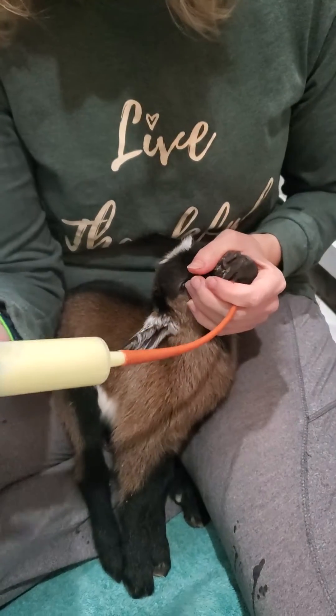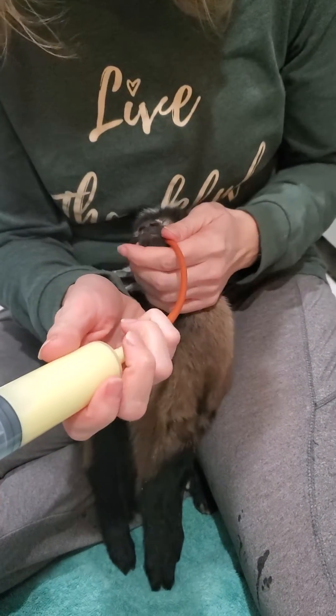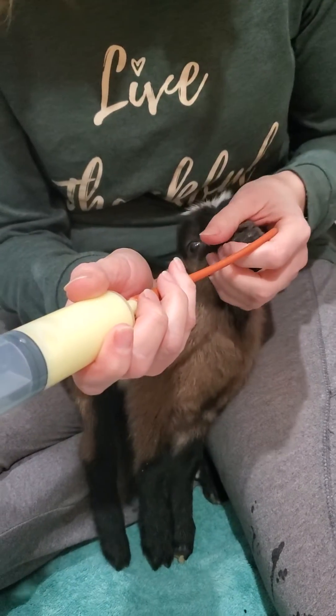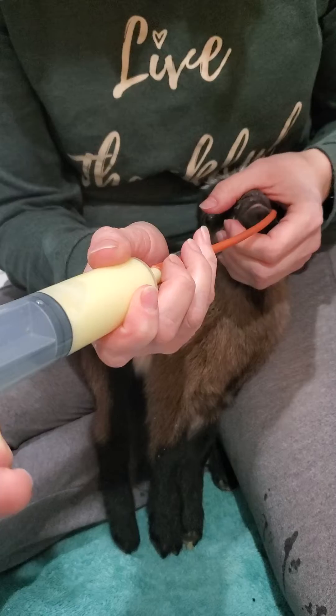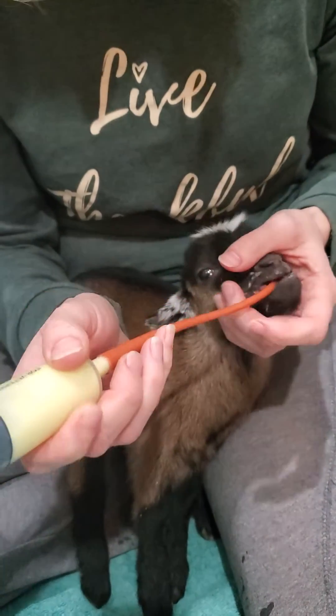There it goes. I'm gonna have some help here — push the plunger down because I don't want her to spit this out. In this process you're okay, probably pee on you so don't wear those clothes.